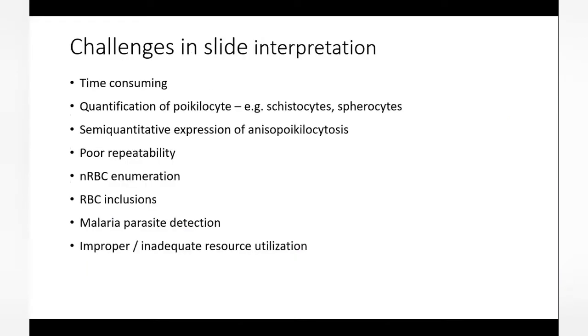And one of the major challenges in slide interpretation is that it is very time consuming. When I say time consuming, I mean not for all the slides, but we do know that when we are reviewing, we have to pay a lot of attention because we don't always know or have adequate information on the patient's clinical side of things.